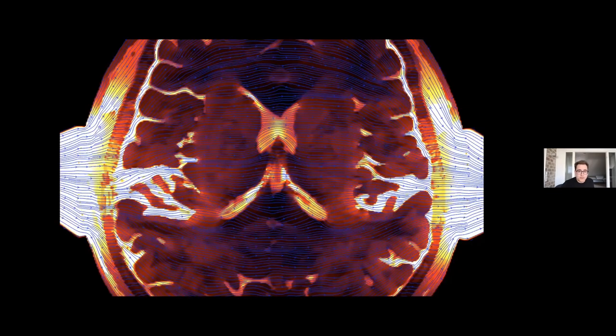The principle of how tDCS works is to attach the electrodes and apply the current. And the current will flow through the head. So it will go through the skull, and then some of the current will penetrate the skull, flow in the CSF, and some of the current then goes to the brain, where it could have an effect. When you do the calculations and determine how large the electric field in the brain is, it turns out that it is in the range of 1 volt per meter. In animal experiments, it has been found that this order of magnitude of electric fields could cause some effects on the function of neurons. So in this sense, at least, tDCS seems to be feasible.